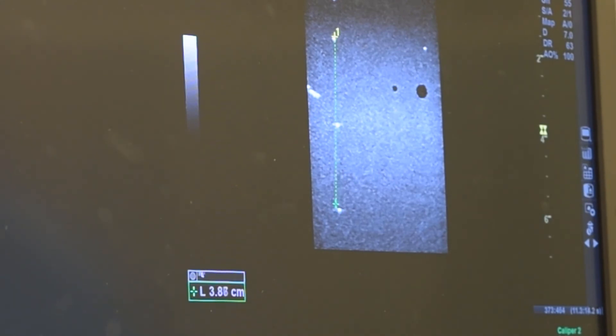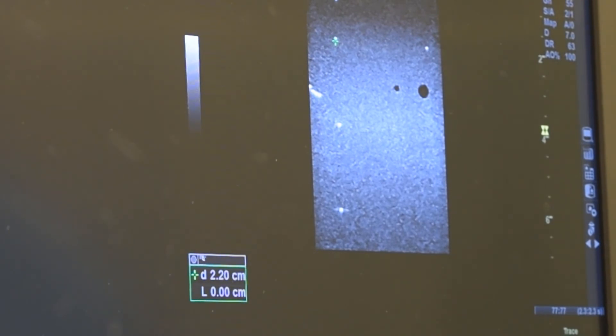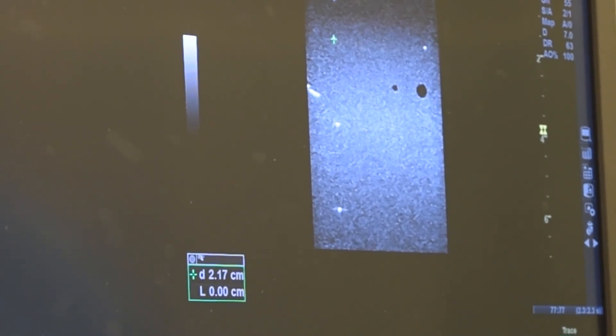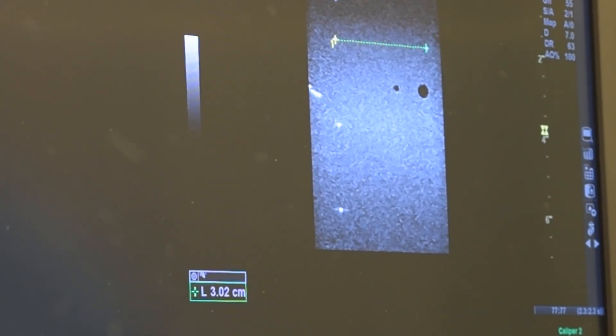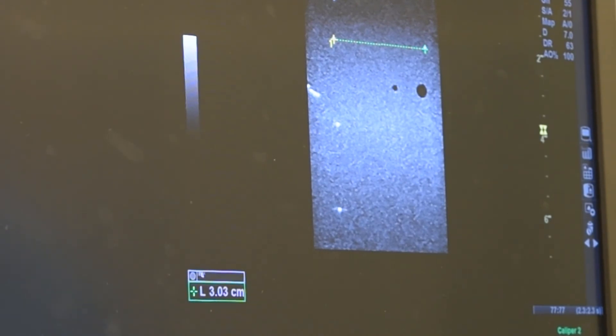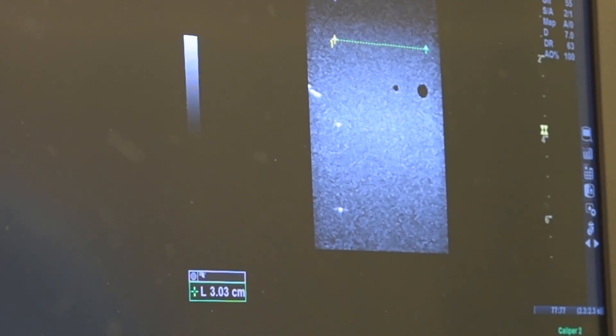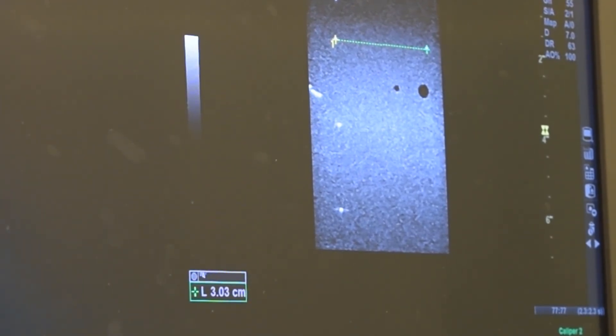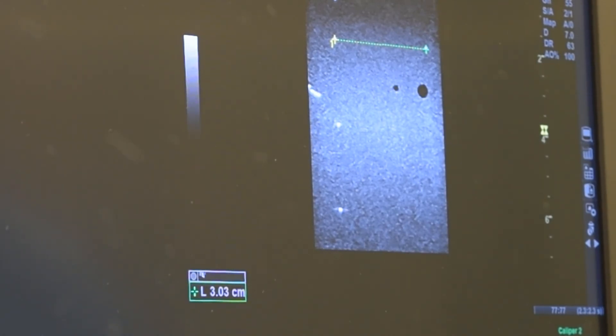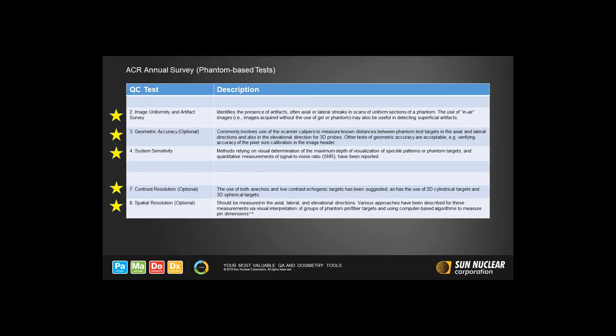We also assess the horizontal measurement accuracy of the transducer and system. Here we've generated an image of the top row of fiber targets. We'll set the cursors to measure the distance between the top two reflectors in the phantom. We always place the cursor in the middle of the first target and then extend it to the middle of the second target. These targets are known to be 3 centimeters apart. Our readout is 3.03 centimeters, which is in excellent agreement with the known distance. Although ACR now lists distance measurement accuracy tests as optional, they are easy to do and a good practice for proper measurement method. And when using horizontal measurements made from images reconstructed from 3D data sets, it is still good practice to do these sets of assessments.